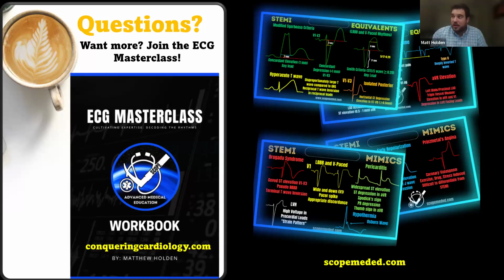I know I kind of blew through a lot of different topics, but I wanted to cover a lot. It's a lot easier when you're able to break down because STEMI mimics alone can take about 30 minutes going through a lot of stuff. Equivalents is another big topic that can take another 30 minutes to an hour, really diving into each one of them. That fib one, wow, would be helpful to see next to torsades. I can definitely see if I can find one. Drugs that exacerbate Brugada syndrome, WPW.